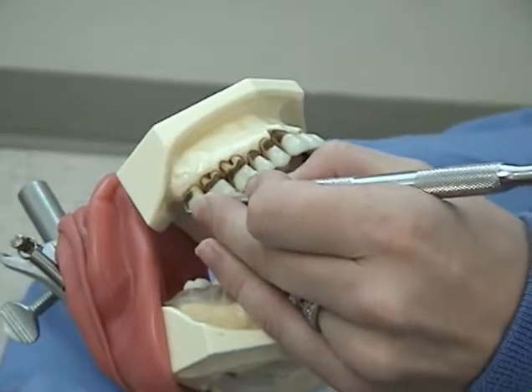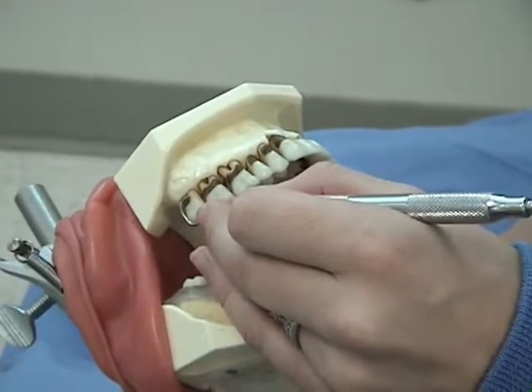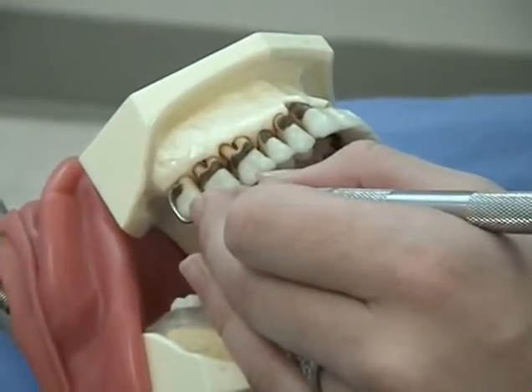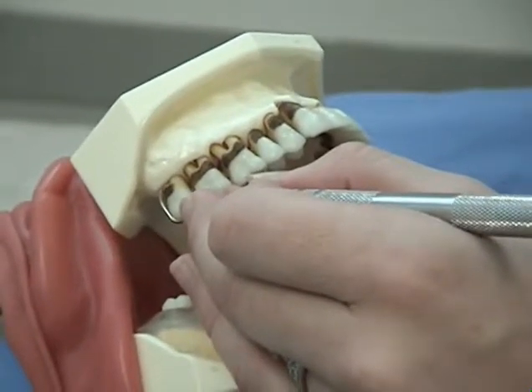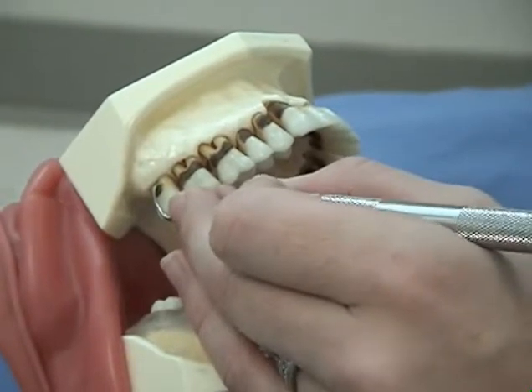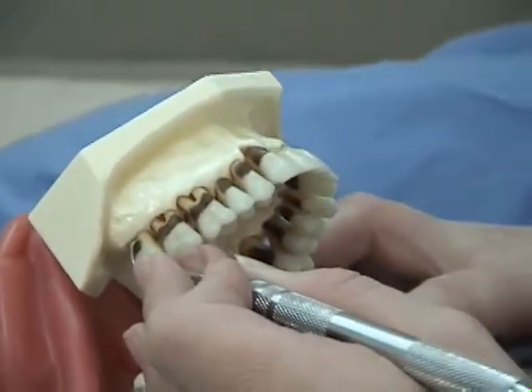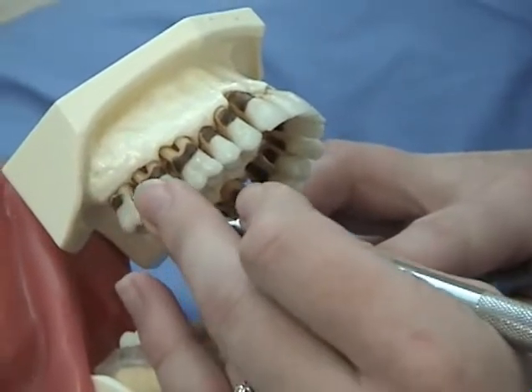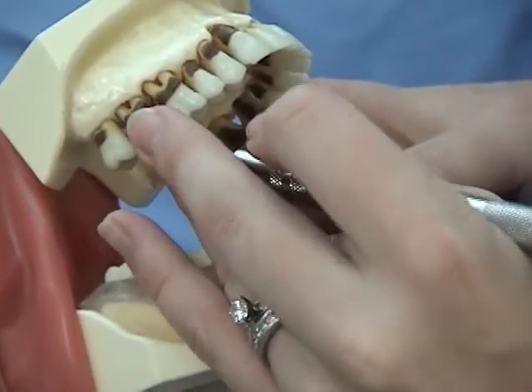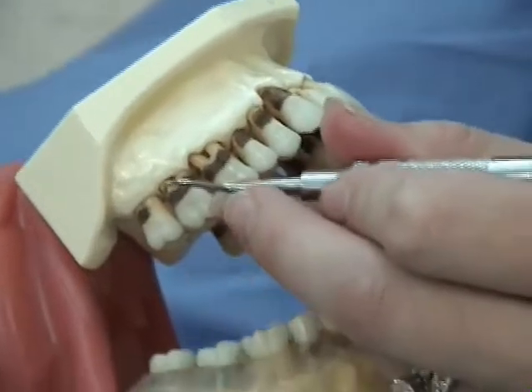You are now ready to instrument the facial and mesial surfaces of the tooth. While maintaining your fulcrum, lift the working end away from the tooth and turn it so that it aims toward the front of the mouth in the mesial direction. Re-position the working end at the distal facial line angle with the toe aiming forward. Re-insert the working end in a closed position. Open the face and check that the terminal shank is parallel. Using a wrist rocking motion, work along the facial surface. When you get to the mesial facial line angle, roll the instrument and pivot on your fulcrum to re-adapt the toe third of the cutting edge to the mesial surface. Work at least halfway across the mesial surface from the facial aspect.